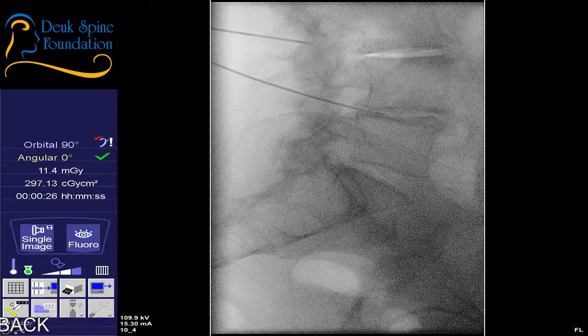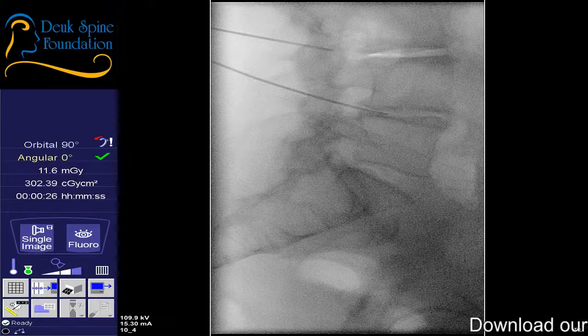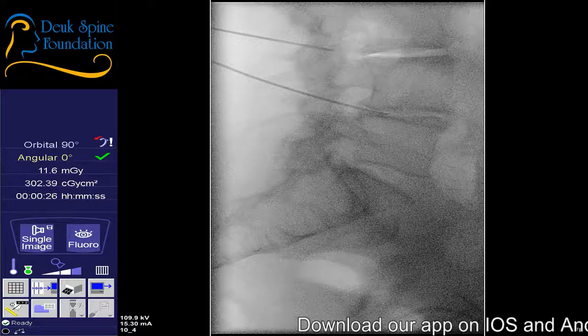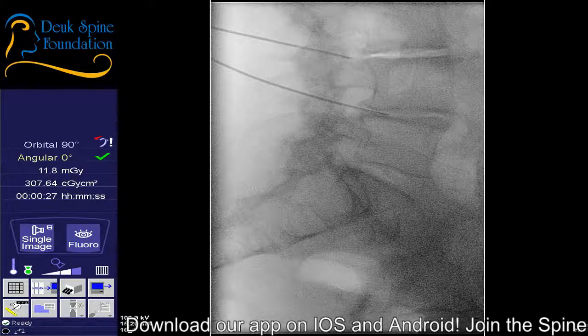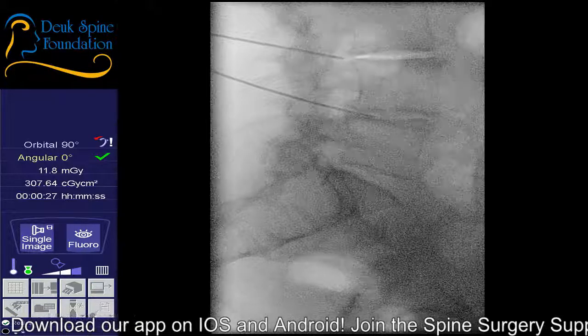So we're aiming for 3-4 now. And I'm feeling a lot of arthritis here, a lot. And that's the degenerative disease of the spine. So people ask me, does this surgery work for degenerative disease? The answer is yes.